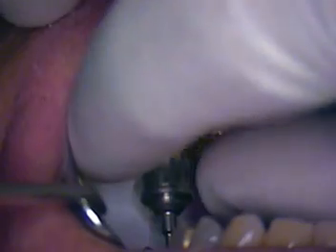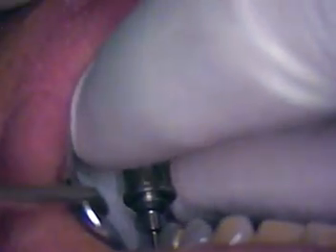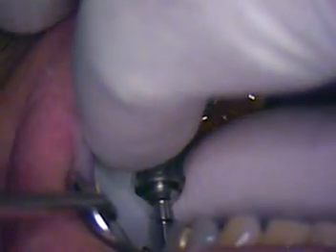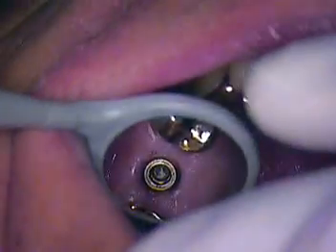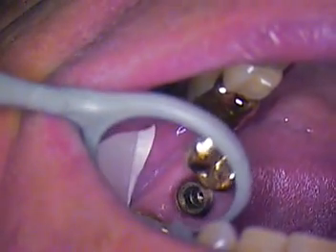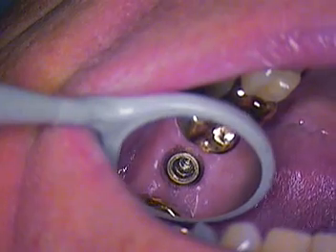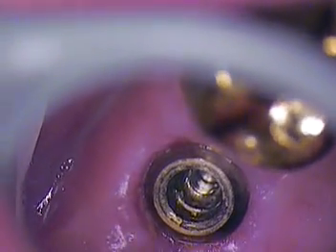Straumann makes a star wrench that grabs also. It has a nice little tendency to hold on to healing abutments, so we can pull that out and not drop it. Okay. And there's the head of the implant itself. Tissue height is actually not 2 millimeters. It's almost right to the hub of the implant.